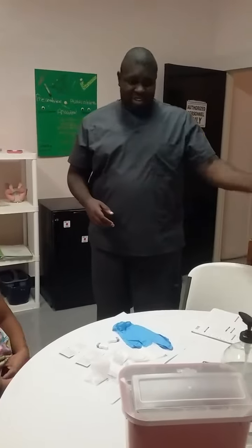Today I'll be going over the bleeding time test, and we're going to take it step by step so you can understand each and every part of it, because it's all pretty linear. All you have to do is follow each step, and we're going to take it one by one so you can all see how it's done. It's not all that difficult. We're just gonna take it one at a time.